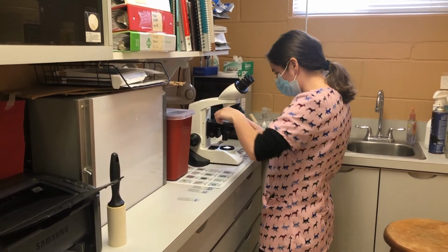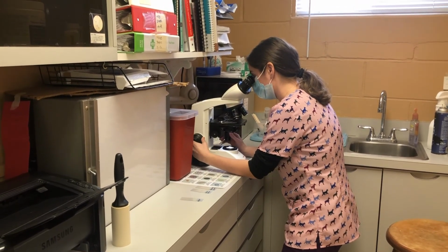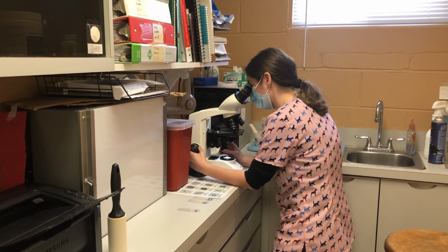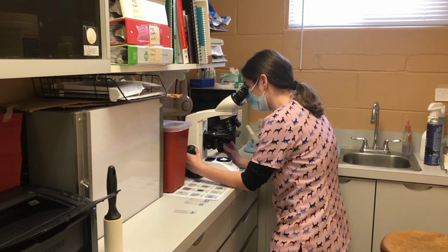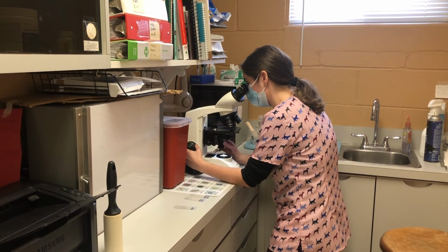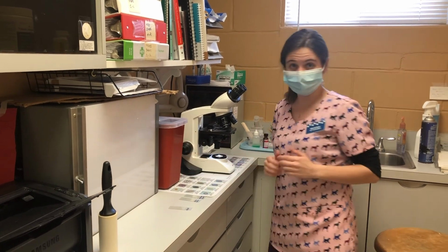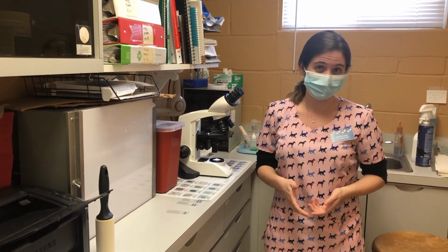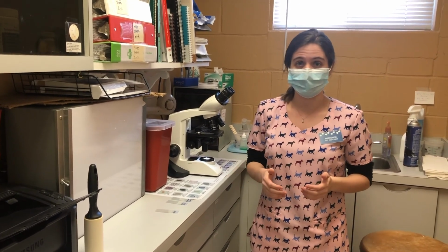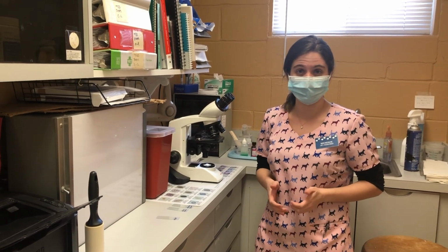Now we're going to look at our minor. And again, I'm also seeing some agglutination present. So since there was agglutination present in our major and our minor crossmatch, we can take that as an indication that our donor and recipient are not compatible for a blood transfusion.